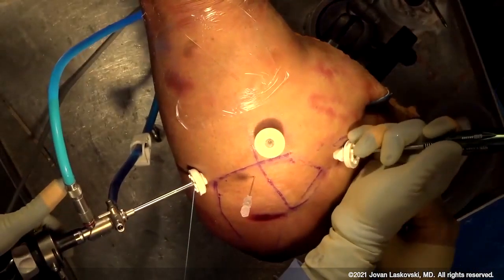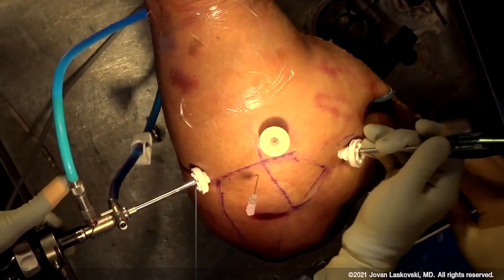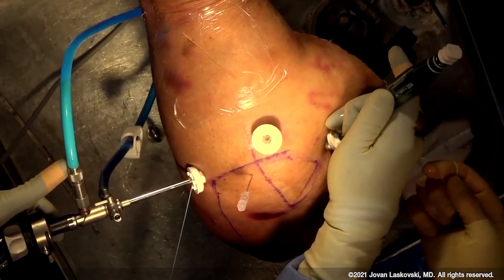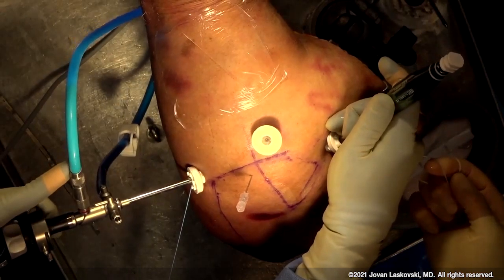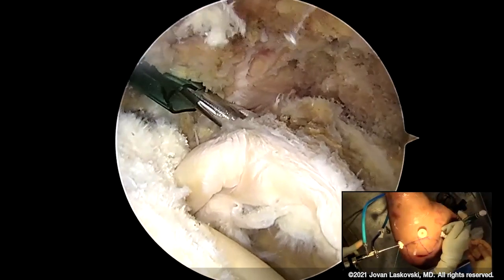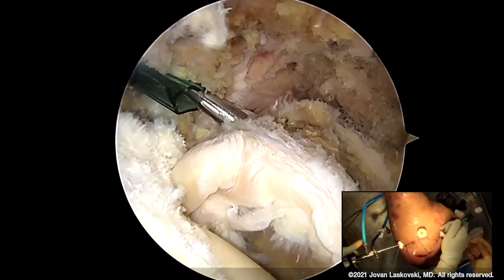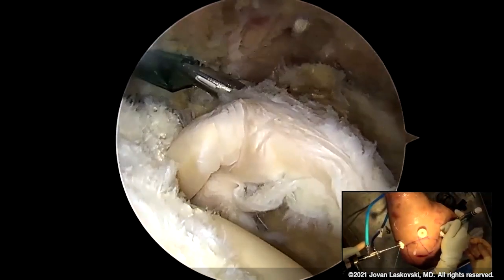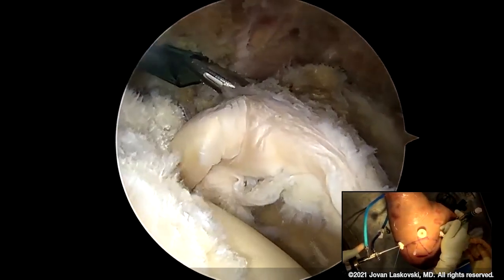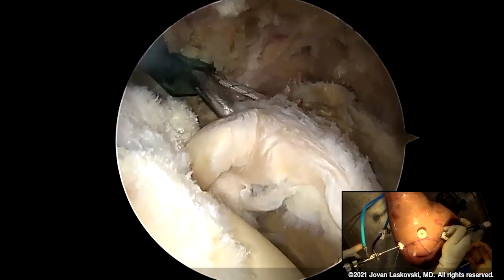Just a quick demo as to how we got here. You can see this is a curved guide and I use a 1.8 double-loaded anchor. In the early days of my SCR experience, we left both sutures in there in case we had a dog ear or a little wrinkle in the graft. You want to make sure that you have a view where you can see the glenoid very clearly and ensure that you're not going to burr or drill through the articular cartilage.